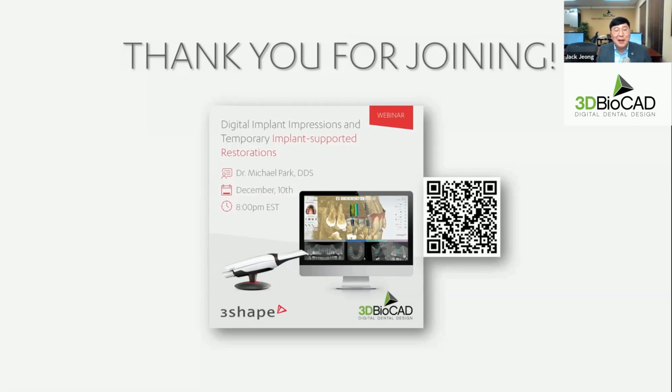Yes, we have it, but Dr. Park doesn't, so that's why he didn't use it. When a doctor wants an all-on-4 or all-on-6 as an immediate load, I can do a screw-in bridge style and also a full denture style. So there's no special reason not to use it.